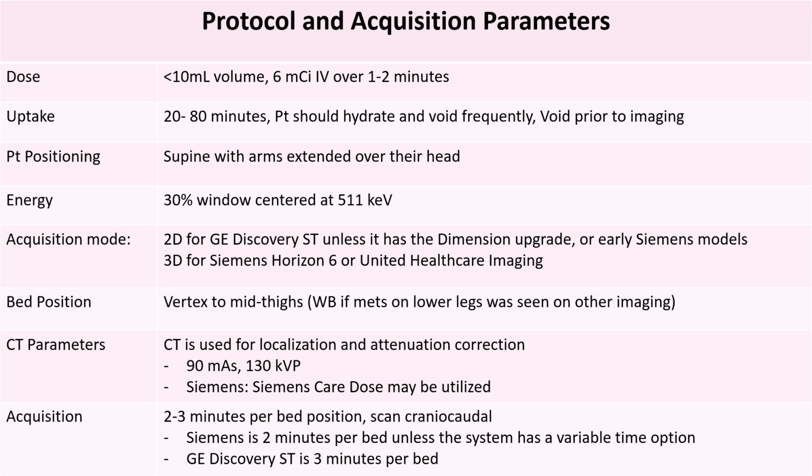And then the uptake, like I said, 80 minutes is most common. You want probably at least 60 to 80 minutes, but you can go as soon as 20 minutes if needed for the workflow of your department. Patients should hydrate and void frequently, though, and they should void before being placed on the table. Place them supine with their arms extended over their head.